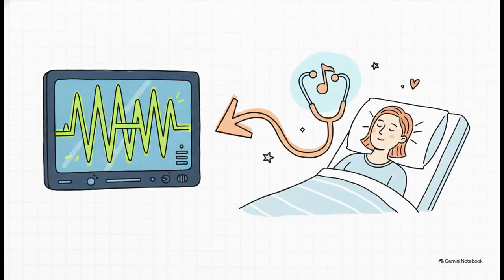So, as you step out onto the floor of the ICU, just remember that perfection is absolutely the enemy of the good. Your ultimate goal is really simple. Let the patient's real-time physiology dictate how you pilot the machine. There is no magic one mode to rule them all. You constantly have to adapt. Keep your ventilation and oxygenation dials separate in your mind, strictly respect the difference between airway resistance and lung compliance, and always be ready to troubleshoot methodically.